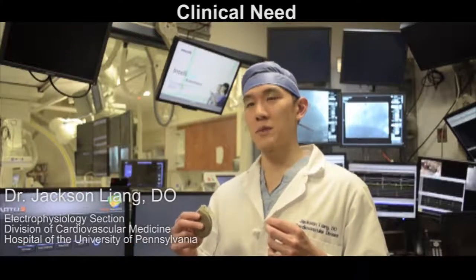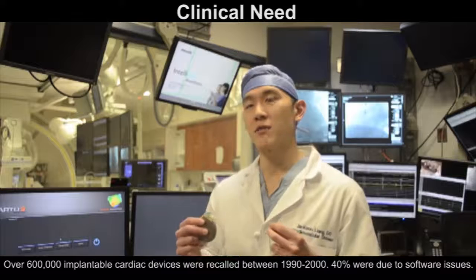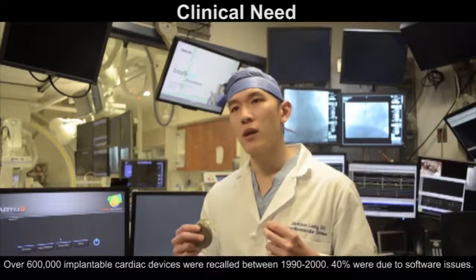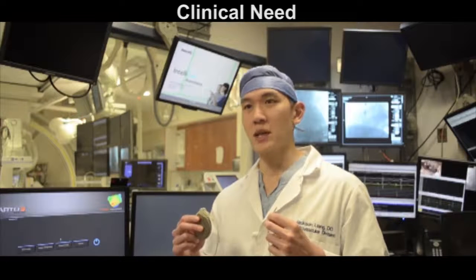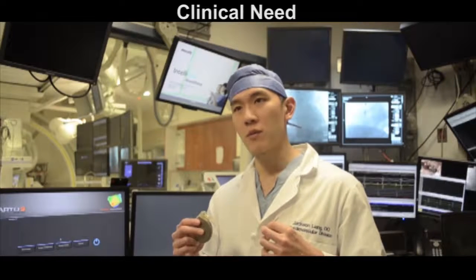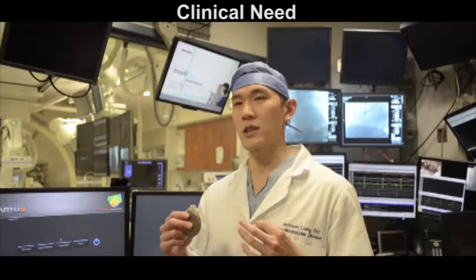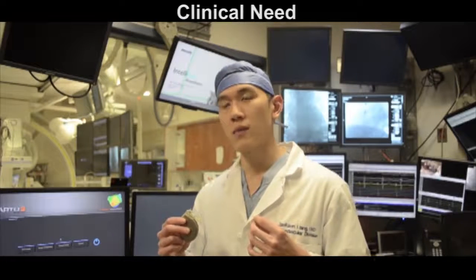Pacemakers and defibrillators are potentially life-saving medical therapies. However, there's a high rate of device malfunction and device recall. Defibrillators can provide potentially life-saving therapies by shocking patients out of potentially fatal rhythms. However, they can also inappropriately shock patients, which can cause harm by causing pain to the patient and also by causing the heart function to potentially decrease as well.